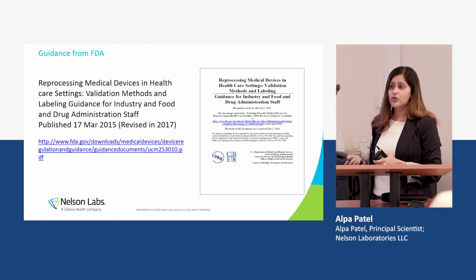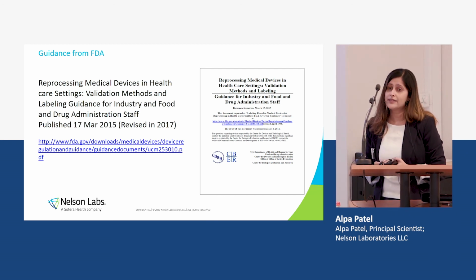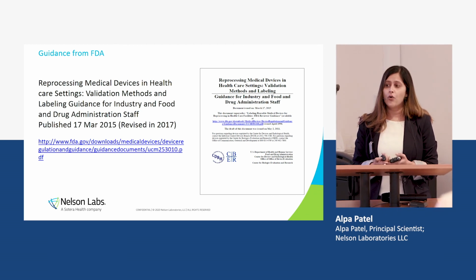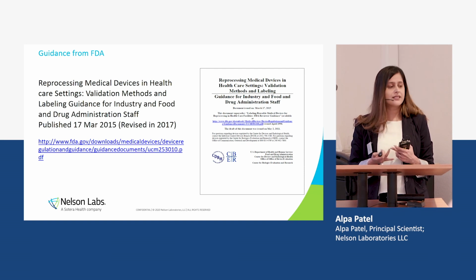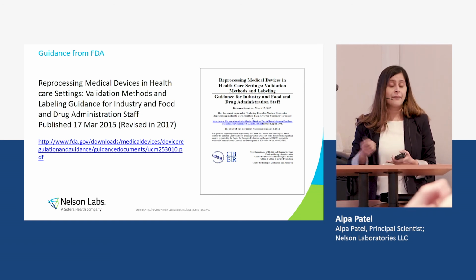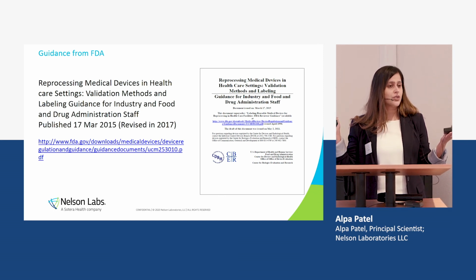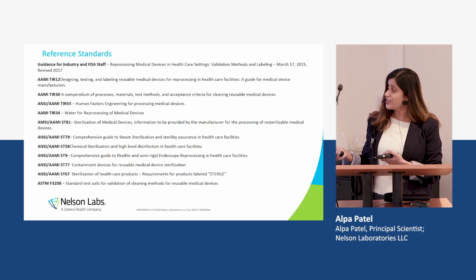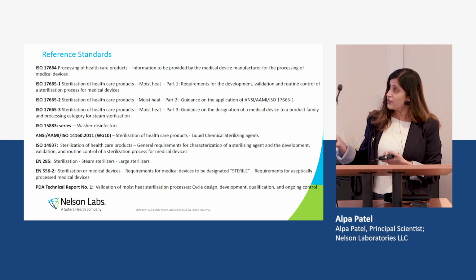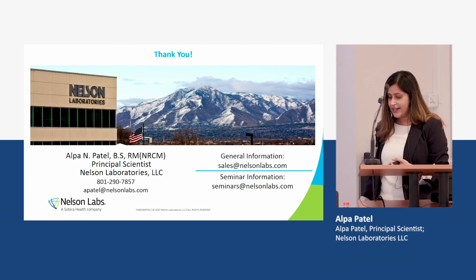If you are in the reusable world and you haven't come across this standard, very, very important standard for US. All the validation methods for cleaning, disinfection, and sterilization and repeated use are in these standards. Are in this document, and EU also will follow this as well. So something to be familiar with. The rest of the slides are just references for reusable medical devices. You'll be amazed how many we have. We have tons of them.